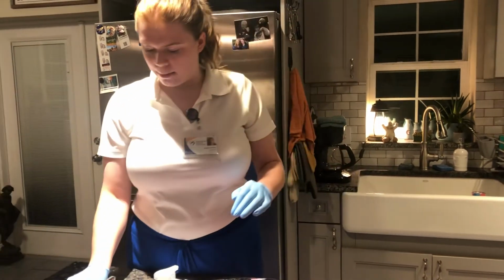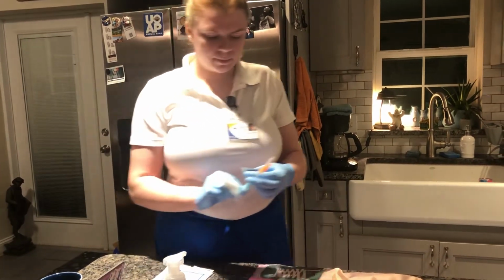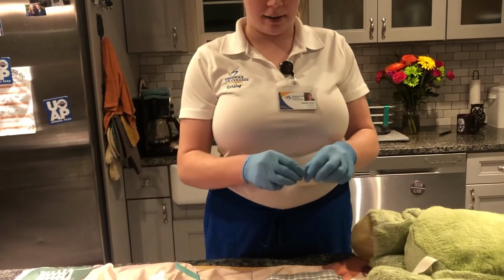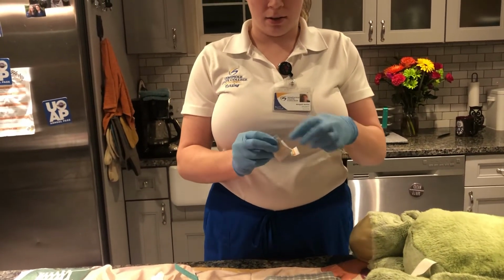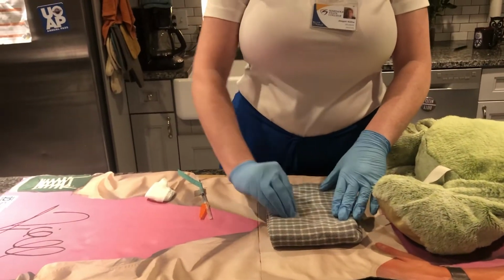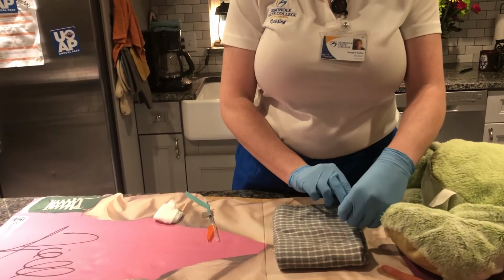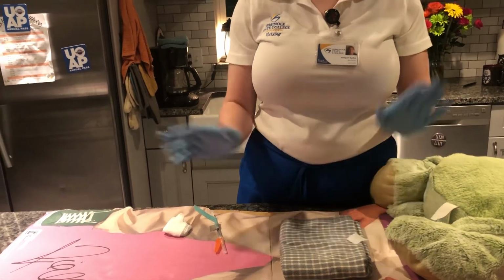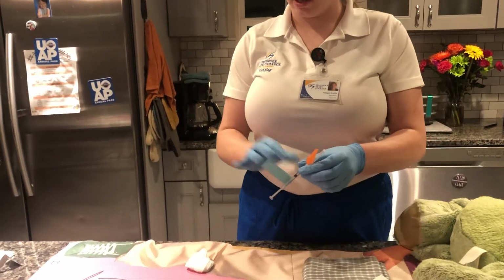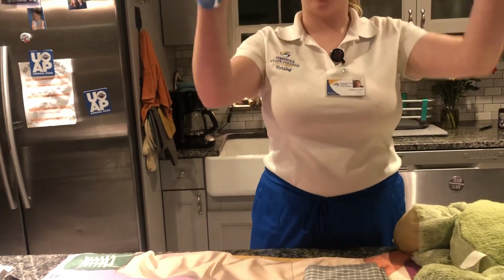All right, and then I'm going to grab my stuff that I'm going to need. Okay, so we would start, of course, by cleaning the area. Dispose of this. I would start in a circular motion going from inward, out, and then we're just going to point out the area that was clean. Okay, and then I would let it air dry, and once that was ready, then I would, again, not contaminating the plunger here, uncap like a rainbow.